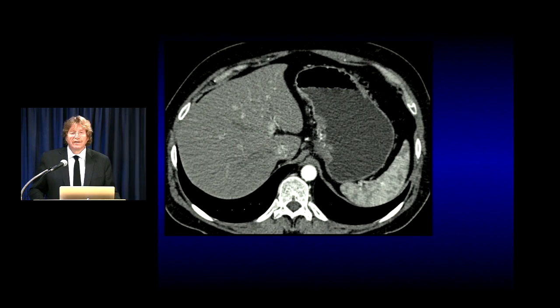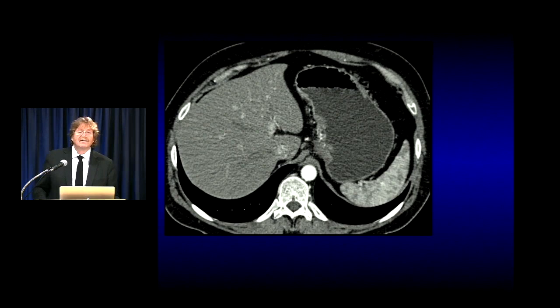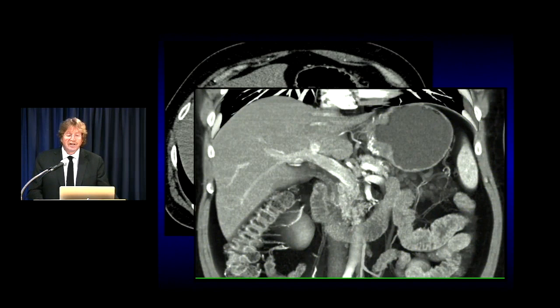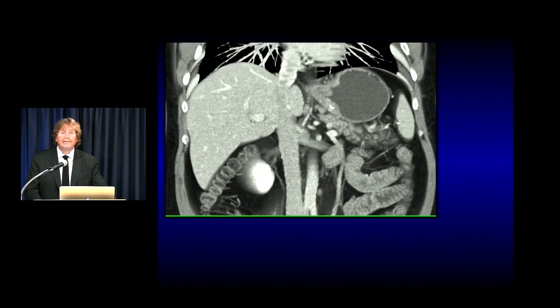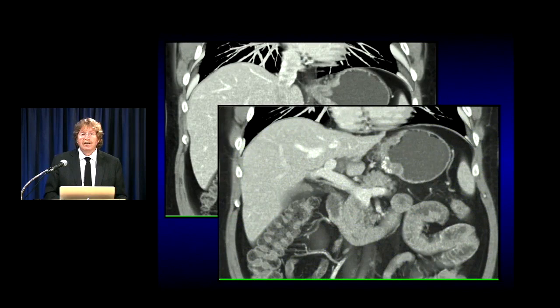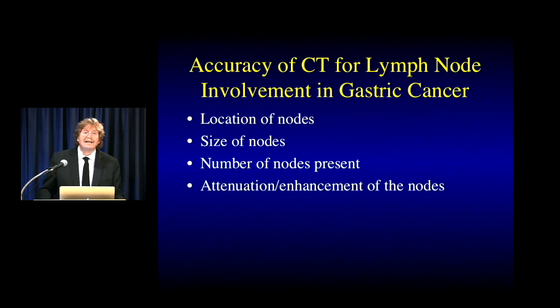Sometimes lesions are more subtle. In this case there's faint thickening at the GE junction — often a challenging area — but there's faint calcification. Faint calcification is never normal. You're uncertain on axial, but look at the coronal view: you see the thickening at the GE junction and the dystrophic calcification very obviously. Mucinous adenocarcinoma — be it colon, stomach, or ovary — often calcifies. That's exactly what this was: a beautiful example of tumor at the GE junction.